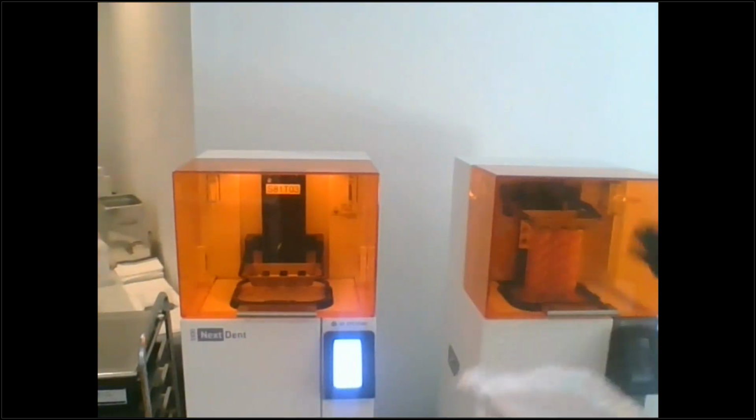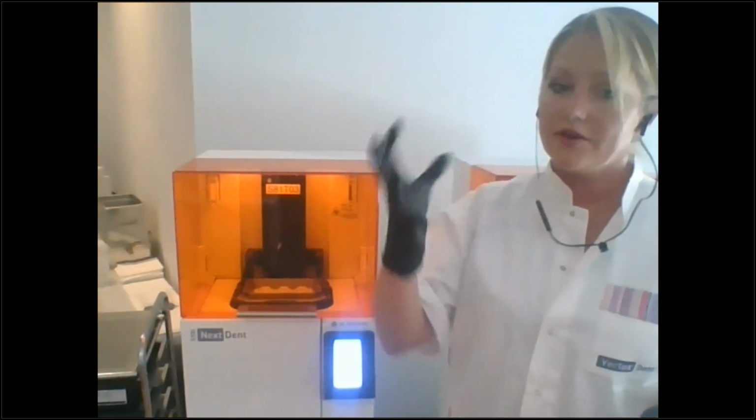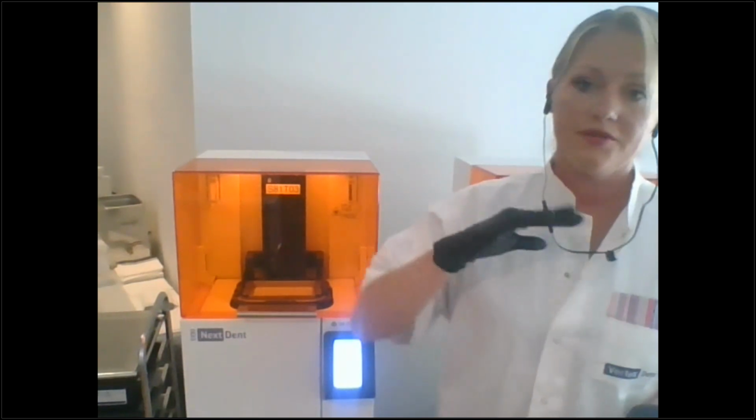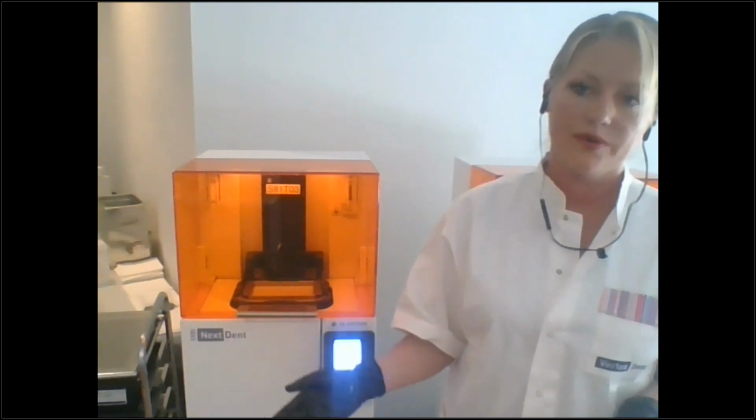Okay. And by the way, it is okay if you leave your models to sit overnight. You don't have to worry about the sagging or anything like that. We've already done all that testing. Everything's fine. You can leave them in there as long as you want.